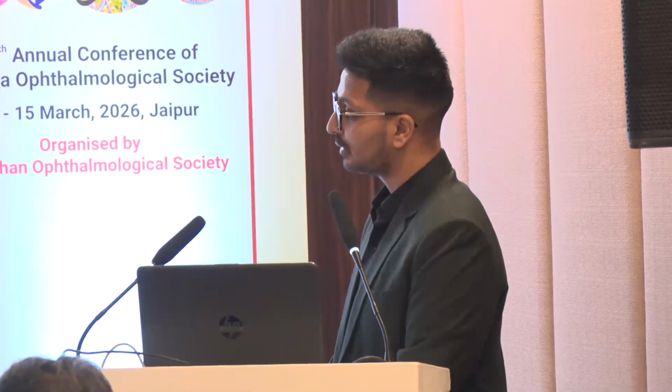Yes, and the only option of an ICL, an intraocular lens, was given to the patient. These patients were chosen only when they didn't want to go for any intraocular surgery. What is the range of power you corrected? The highest power, ma'am, that I had done was around minus 10, minus 11.5 sphere and minus 2 cylinder.